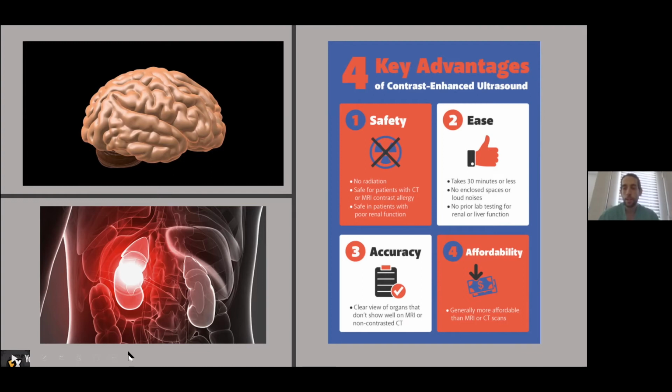And then contrast enhanced ultrasound also has all of the benefits of ultrasound. So it's low cost, it's rapid, and can be done at the bedside. There is no ionizing radiation. And it can be relatively accurate for specific lesions, as we'll get to in a second.